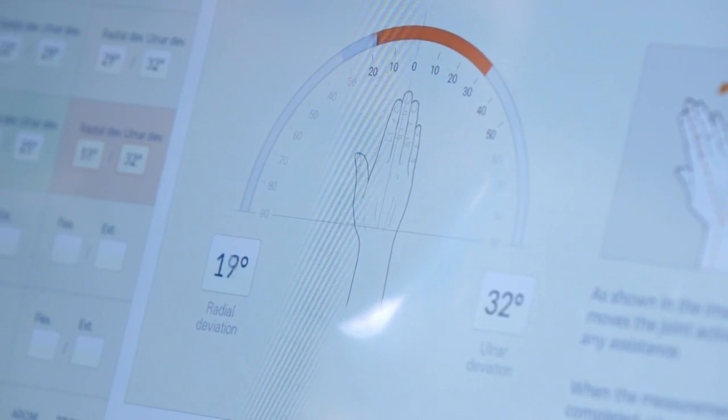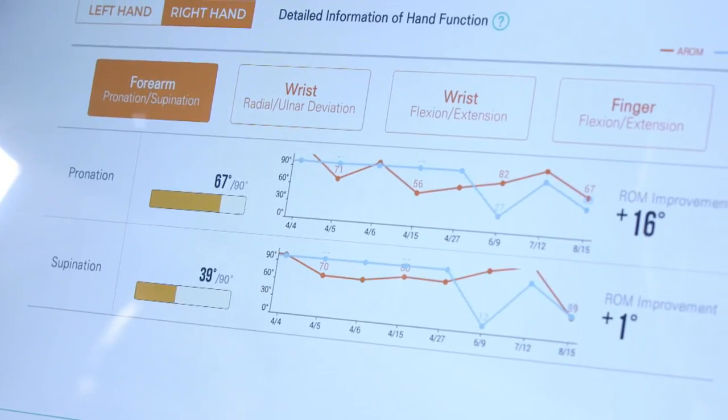So instead of just saying you've been making improvement, now it can be a lot more objective — saying I made progress by three degrees over the past two weeks.